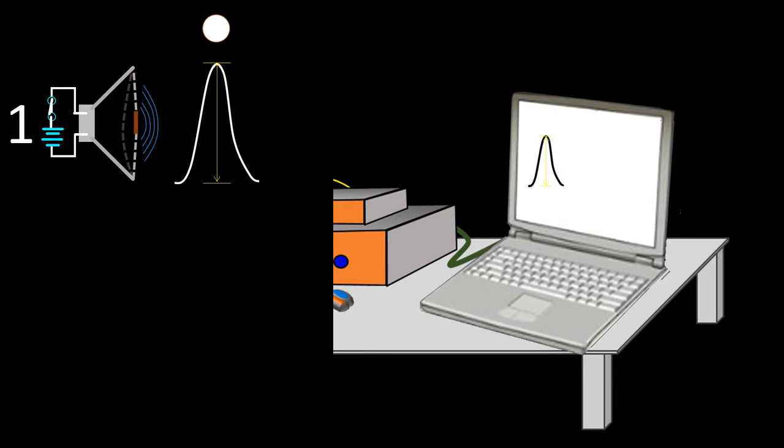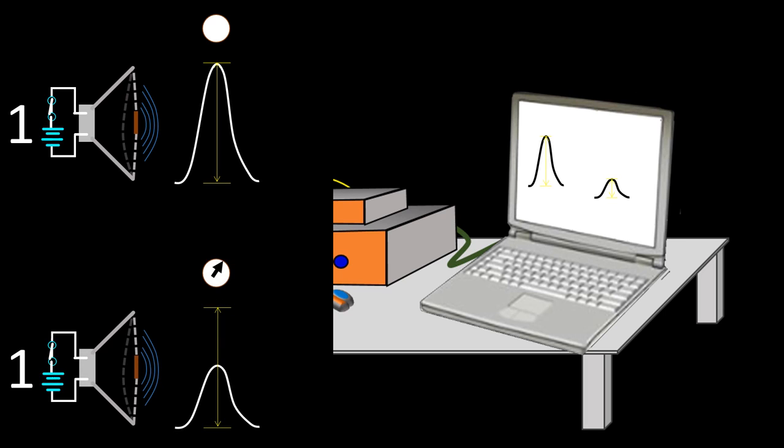A sound signal in the form of a wave with the manufacturer's specifications is compared with the sound produced by a loudspeaker of the headphone, and if they do not match, the sound arising from the earphone is calibrated until the amplitude and morphology of the two waves are similar.